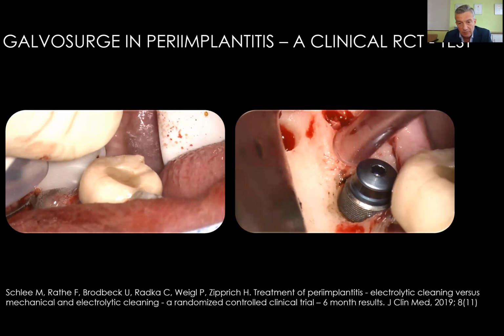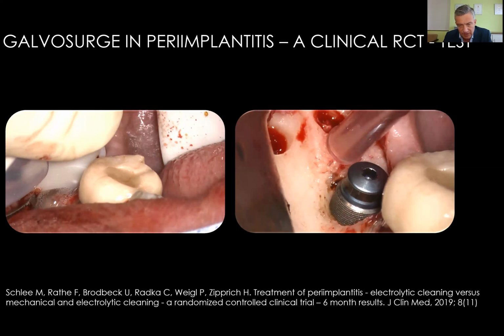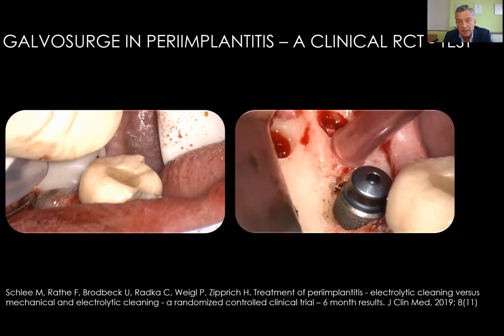You see a coagulum. And I'm a fan of tenting techniques. As you can see, I used a cover screw 2 millimeters high, and then we augmented to the top of this 2 millimeter healing post. Why do I do that?